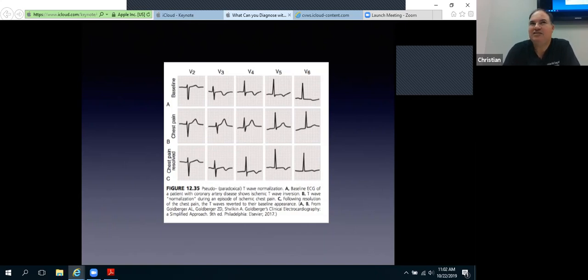These are tough diagnoses to make. You would never know that if you just get the EKG brought in front of you from triage. It's why, when you're doing EKGs, you've got to tell me if somebody's having chest pain and they don't look good, even if it's a normal EKG. That's what I want to know. Just say, this person doesn't look good, they're having chest pain, I know this EKG looks fine. And in my mind, I'm thinking, well, I need an old EKG to compare to, or a history of old injury. Right.